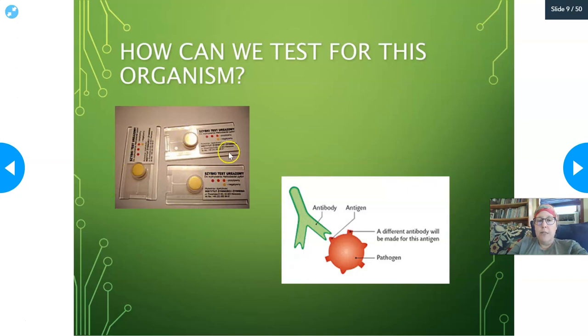and bring it back up, and then you can put it in this test cartridge. This is going to be a biochemical test, and I will explain it in a minute, but basically, if the bacteria is present, it will eventually change color. It takes a couple of days to fully develop, but it's pretty nifty. And then the other very common way to do it.